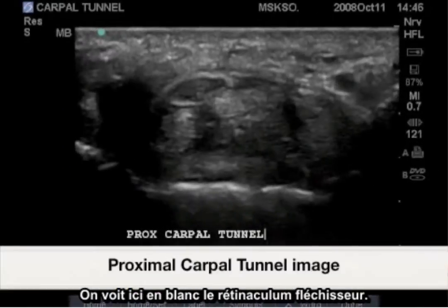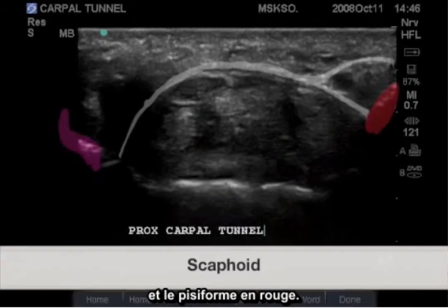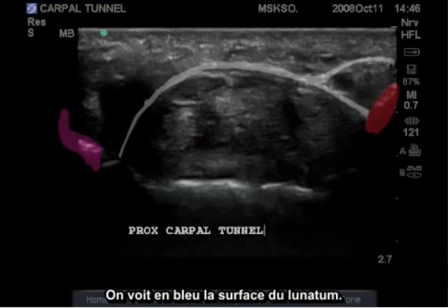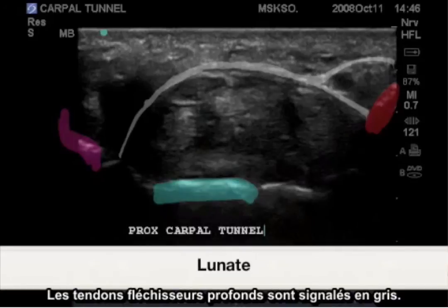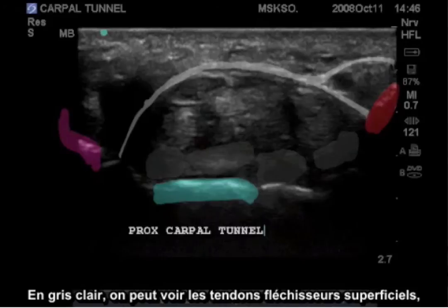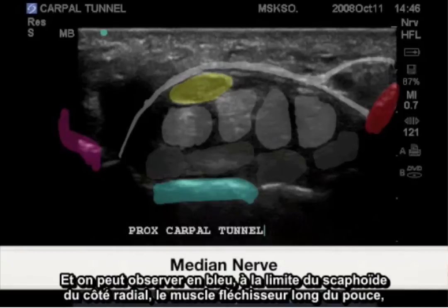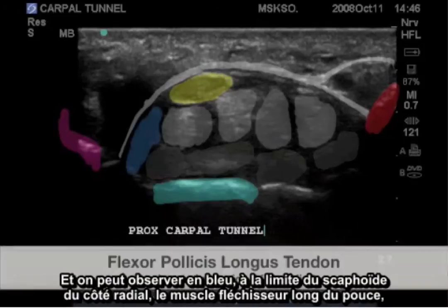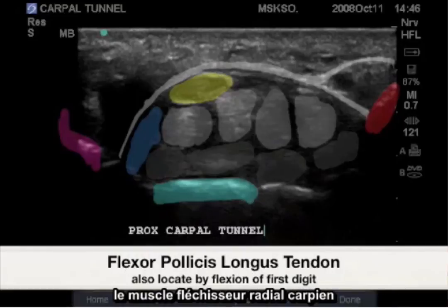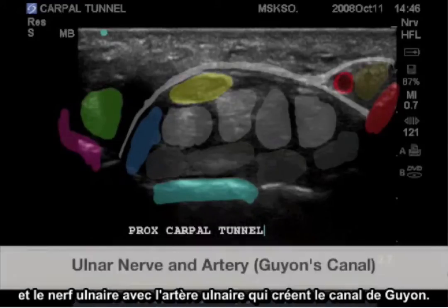Here is the corresponding image. Highlighted in white is the actual flexor retinaculum. Highlighted in purple is the scaphoid insertion. In red is the pisiform. The blue is the lunate surface. In gray are the deep flexor tendons. The light gray are the superficial flexor tendons. The yellow is the median nerve. And in blue on the far radial aspect bordering the scaphoid is the flexor pollicis longus and flexor carpi radialis. And the ulnar nerve and ulnar artery creating Guyon's canal.